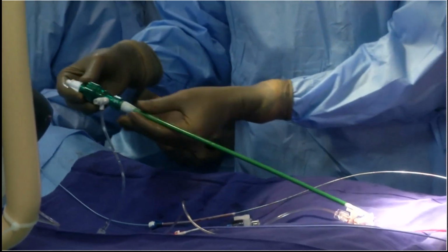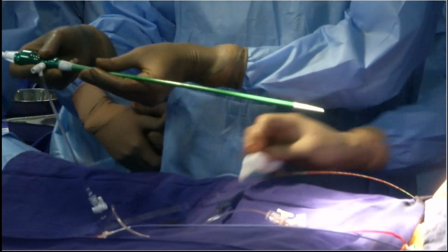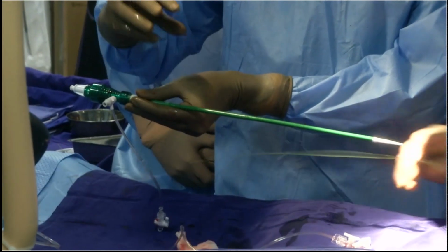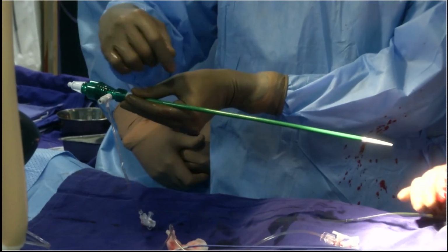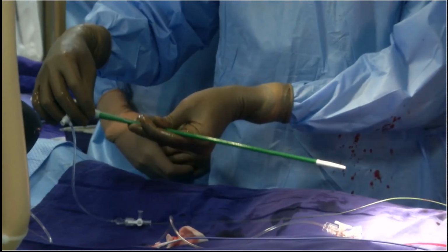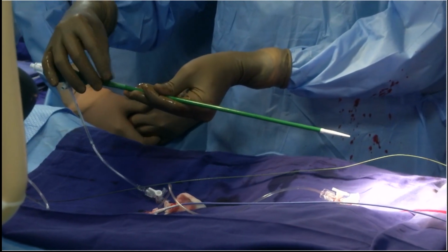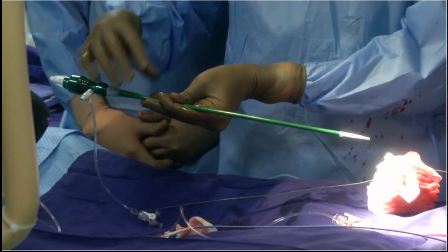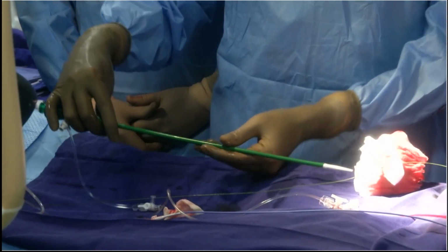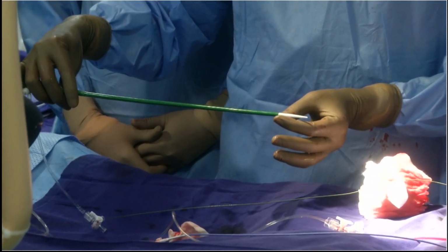The advantage of this sheath is that it is only a 14 French sheath. It's an expandable sheath. When we insert the valve, the sheath expands transiently to allow the valve to move. When we start putting the valve inside, there may be some initial resistance, and once the valve crosses, it becomes smoother. The tip of the sheath has barium and can be seen radiographically.